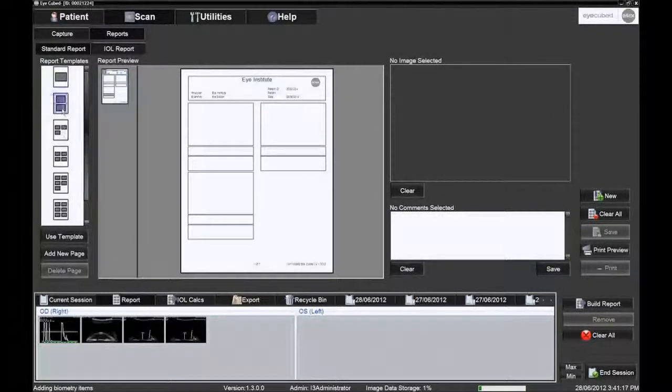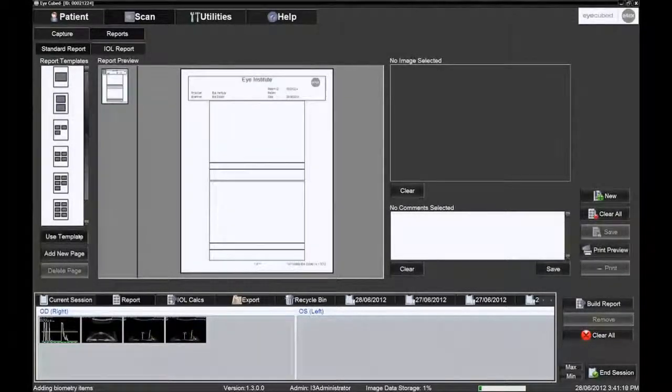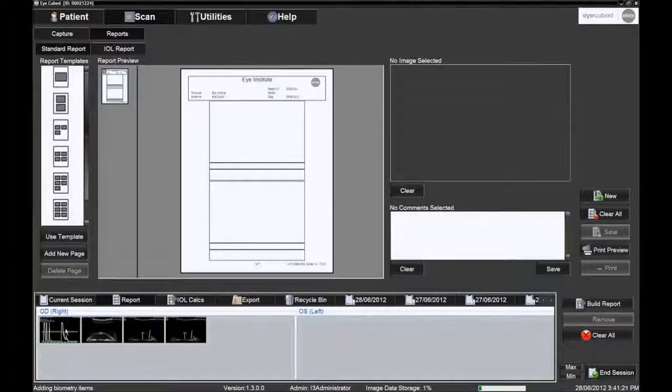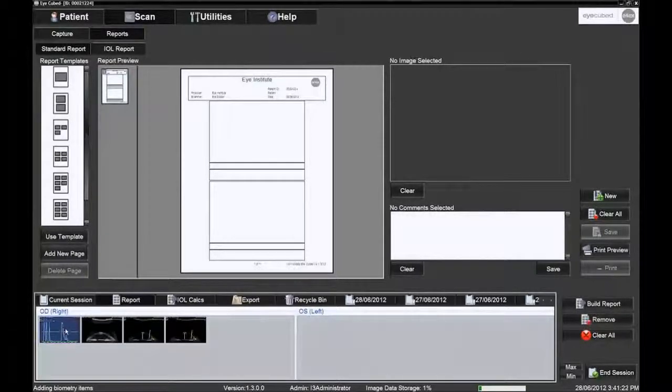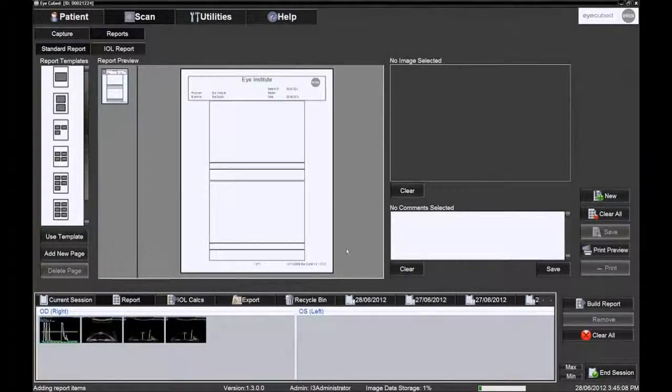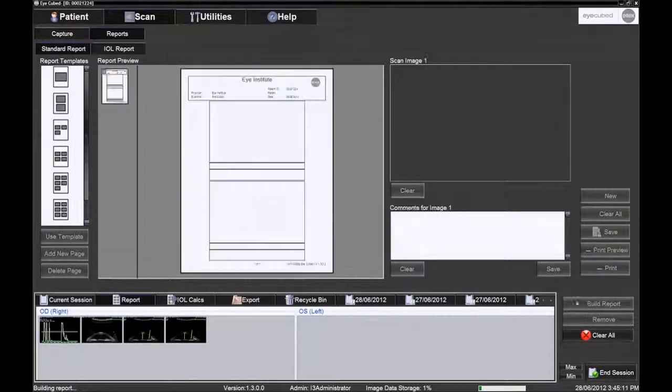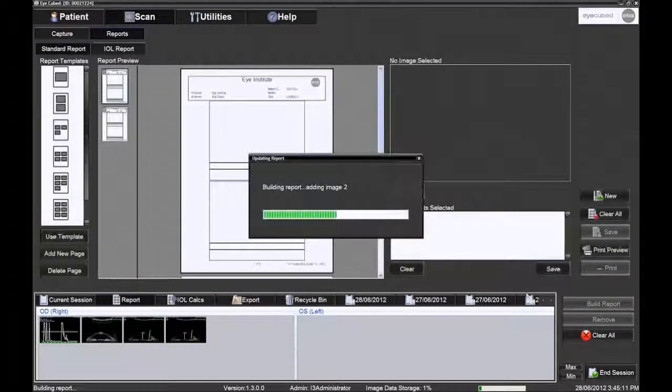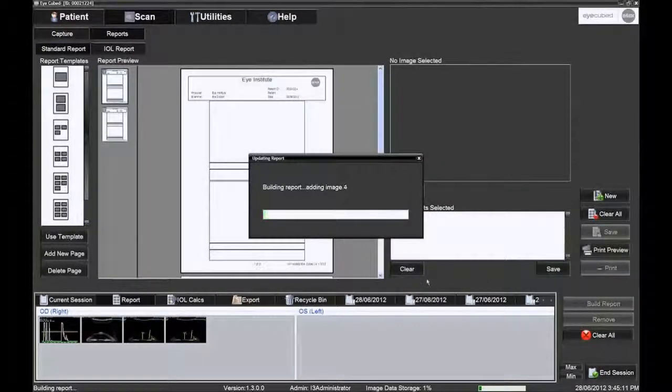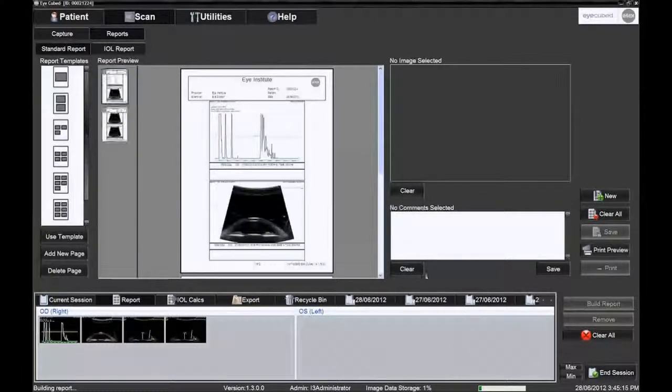Scan images that were selected for printing can now be seen below in the report image tray bin. Scan images can be dragged and dropped into the available image boxes or the Build Report icon can be selected and the images will automatically populate into the report.